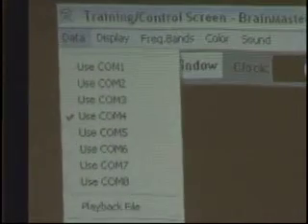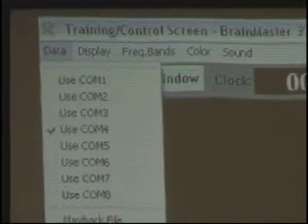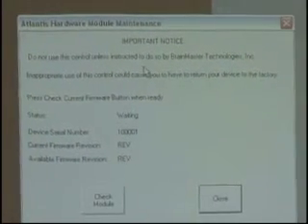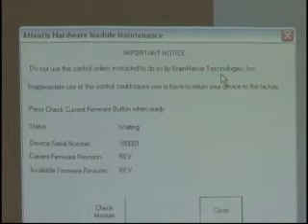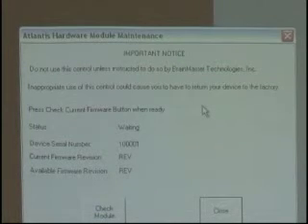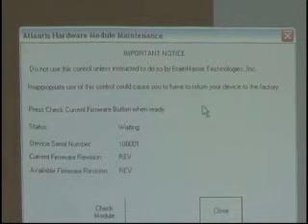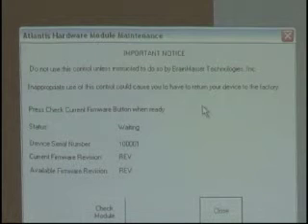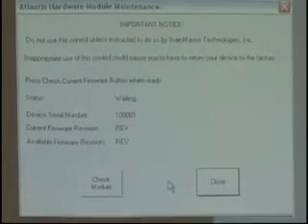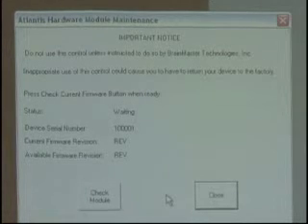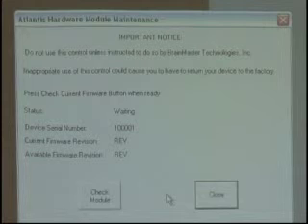Under Data we also see 'Atlantis Setup.' This is where the field firmware upgrade happens. There's an important notice: do not use this control unless instructed by BrainMaster Technologies. If you call in to get the full Atlantis mode and the field upgrade, this is where it happens and we walk you through it on the phone. The reason we do that is if you click buttons out of sequence during the firmware upgrade, you can actually disable your device and it has to come back to BrainMaster to be fixed.